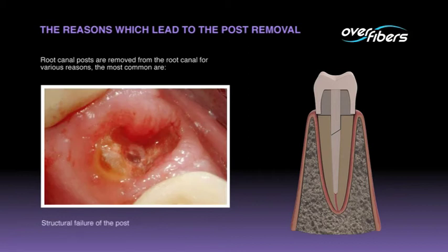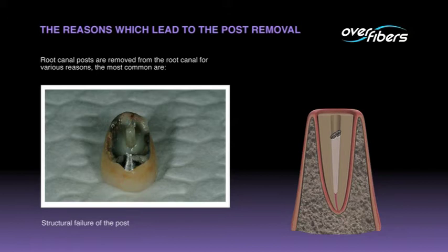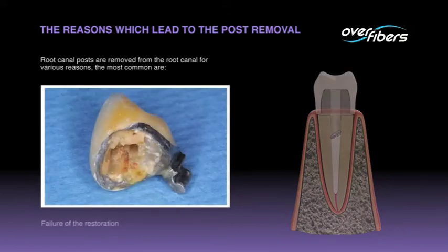Structural failure of the post. Failure of the restoration.